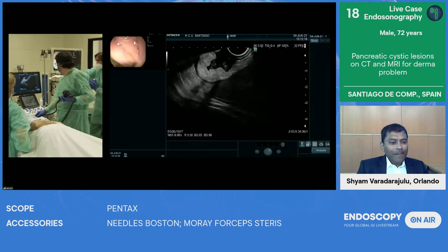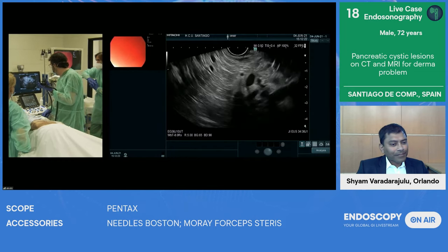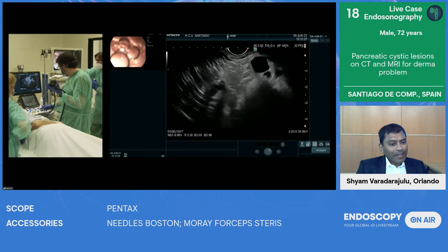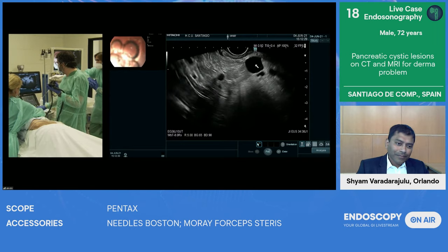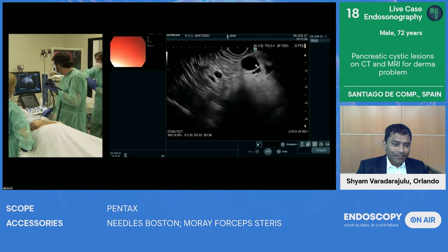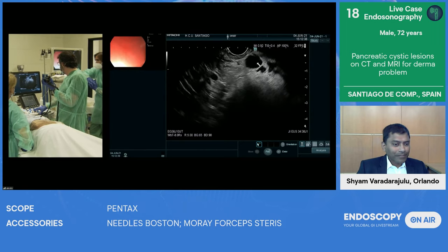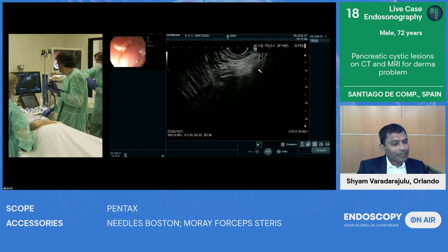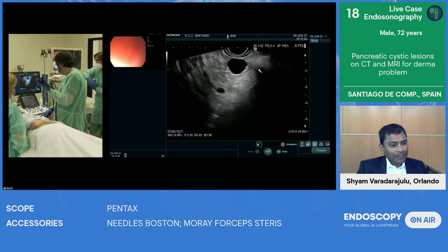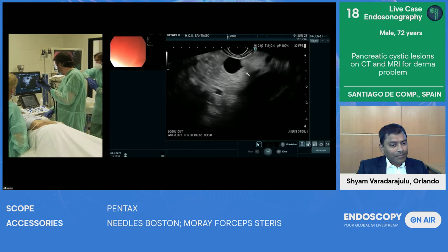So we're just advancing the scope a little bit. We're coming into position. We are going to turn a little bit clockwise, turn right, and then we are going to pull back the scope. Okay, and we start to see something in the pancreas, and this is one of the cystic lesions that we start to see. I'm just trying to pull back. Okay, so we start to see several small cystic pancreatic lesions. So I'm still withdrawing the scope. I'm just signaling with the arrow these cystic pancreatic lesions.